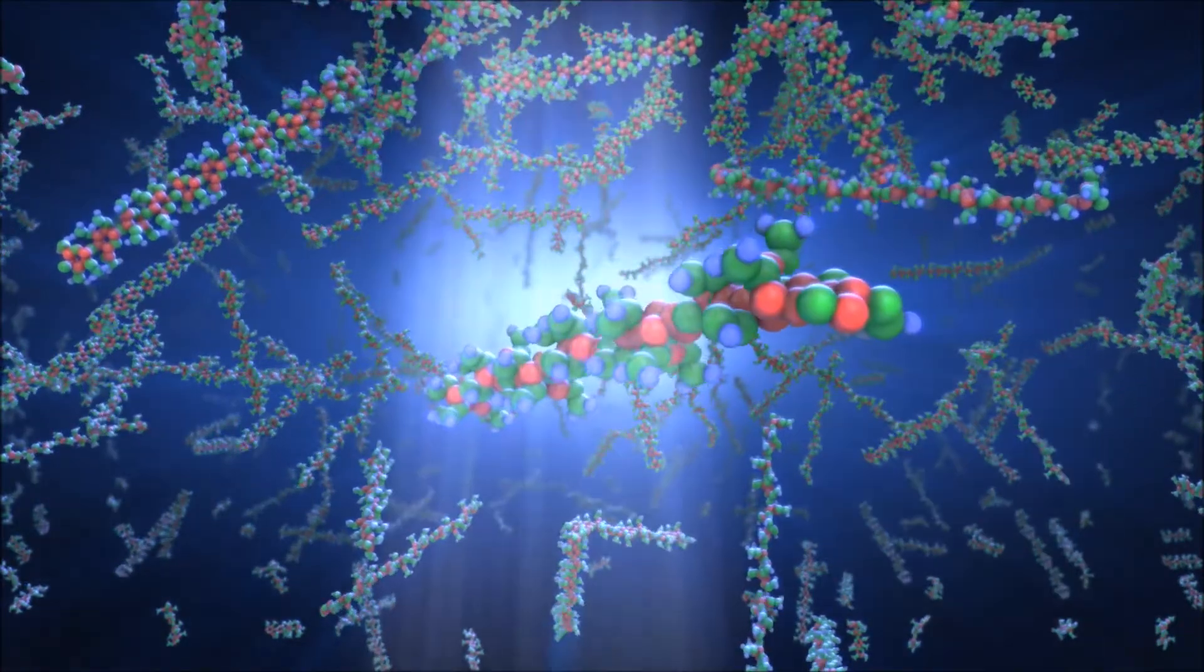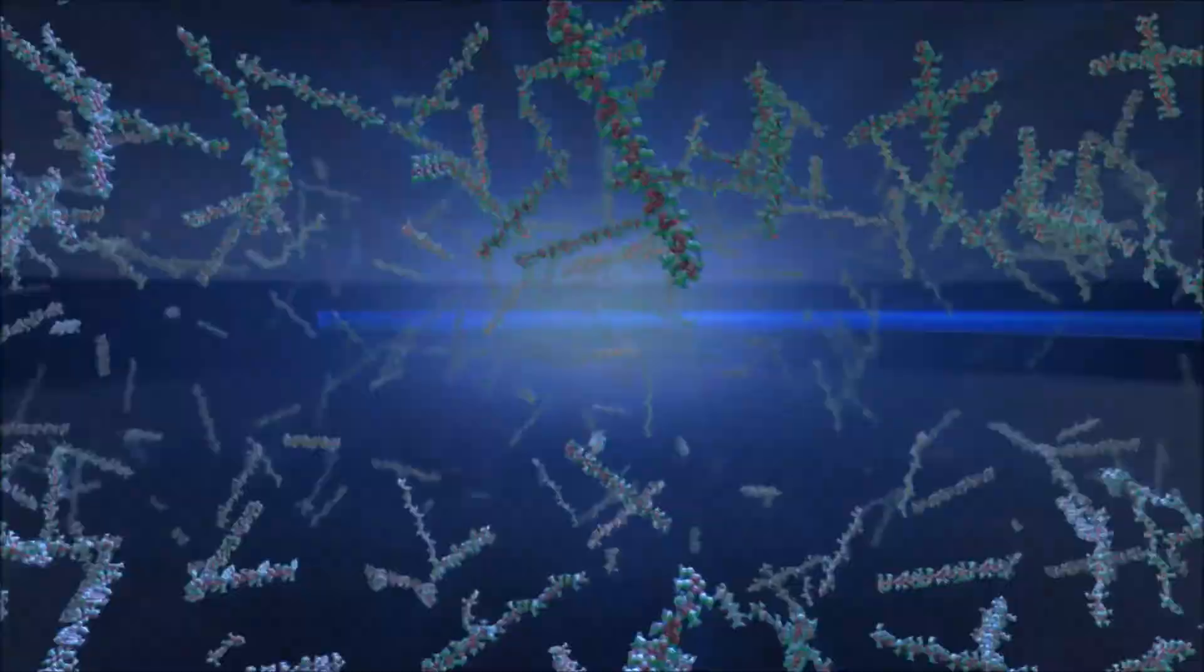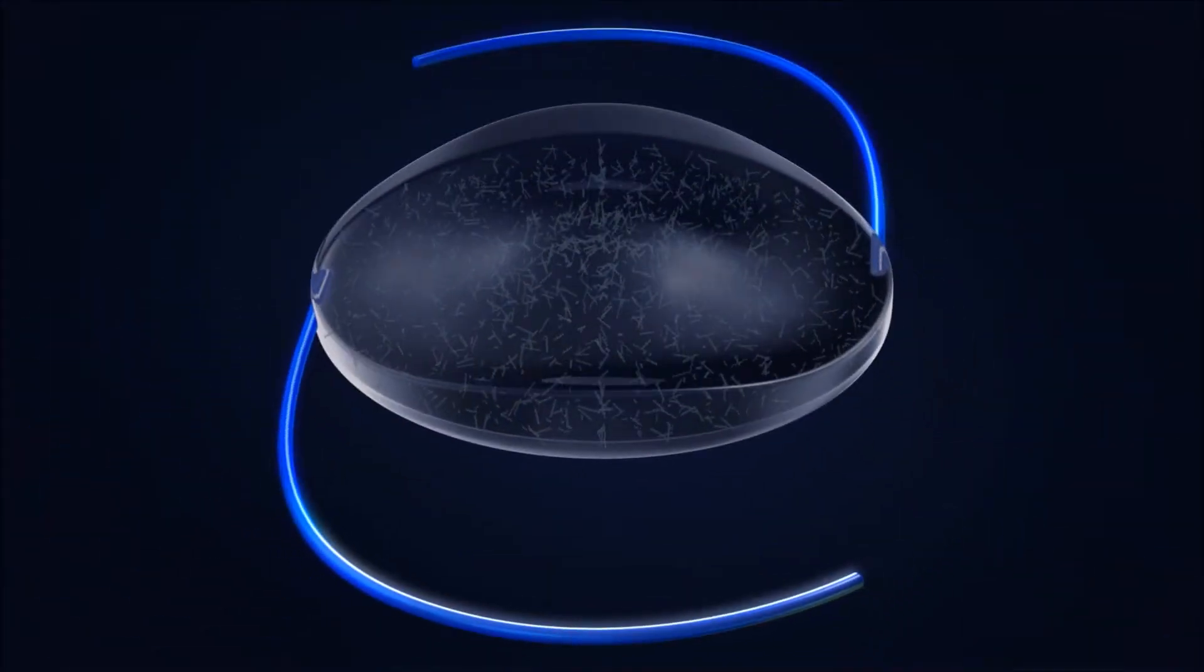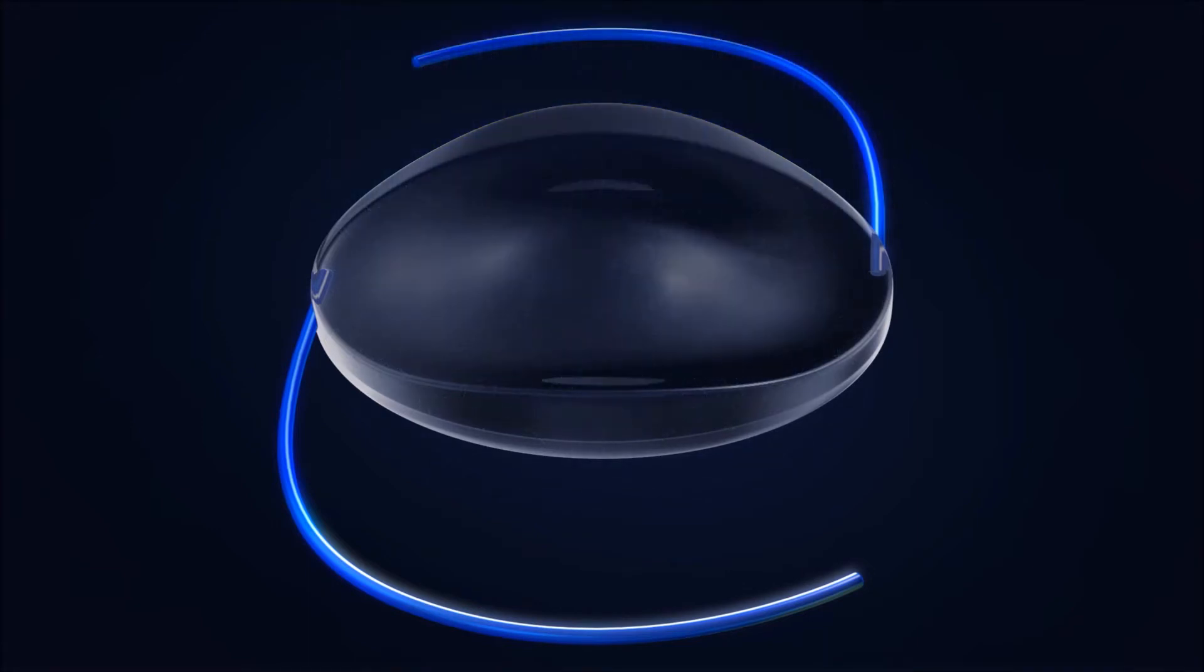When the adjustment process has been completed to the satisfaction of doctor and patient, the entire lens is exposed to the treatment light to polymerize all remaining macromers, effectively locking them in place to prevent any further changes.